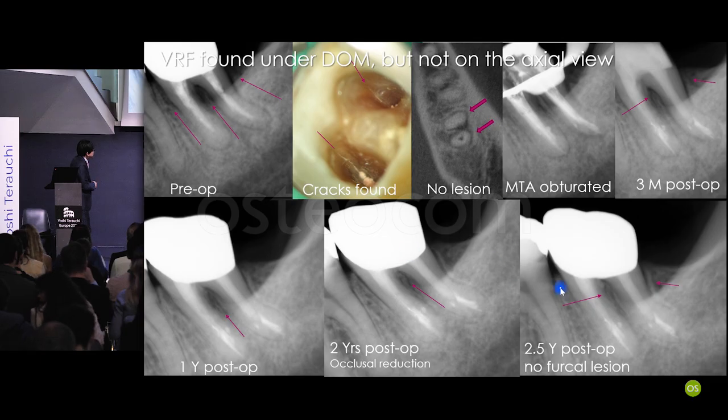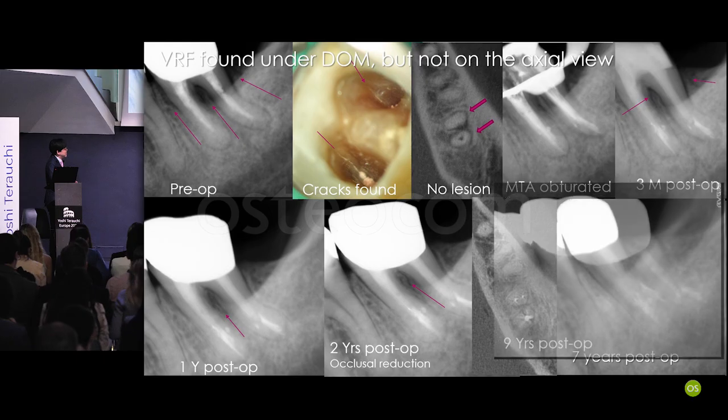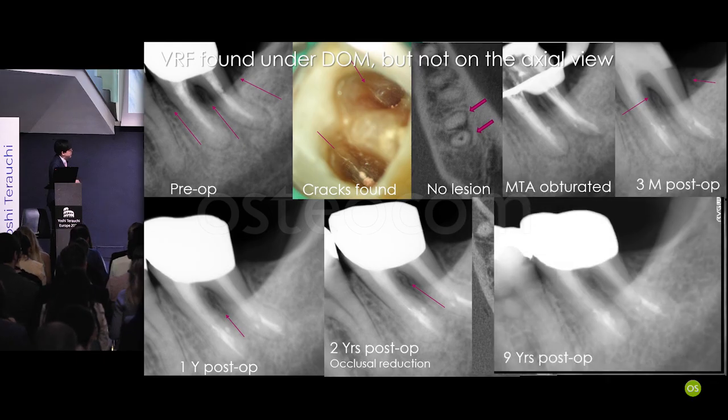Then this is 1 year, 2 year, and this is 7-year post-op. The patient stayed asymptomatic. And this is 9-year post-op. The patient was still asymptomatic. No lesion and no symptom. So if you do that, you could extend the life of the tooth by doing that.